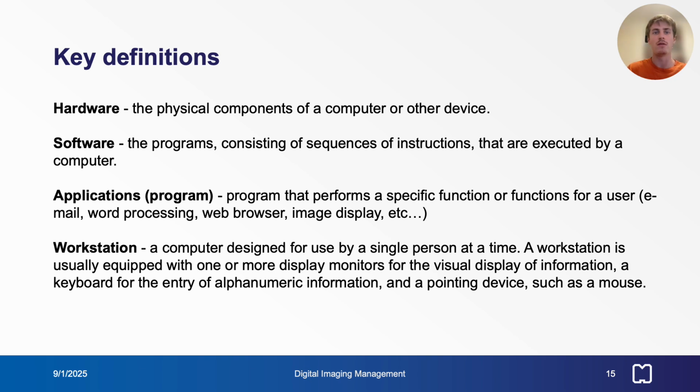A workstation refers to a computer that's designed for the use by a single person at a time. A workstation is usually equipped with 1 or more display monitors for the visual display of information, a keyboard for the entry of alphanumeric information, and a pointing device such as a mouse.